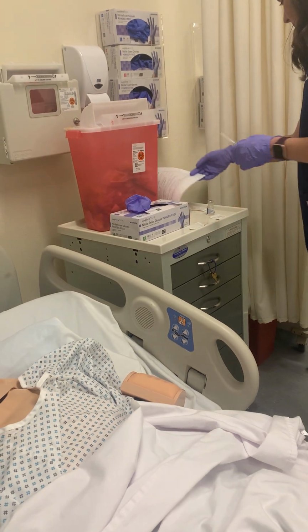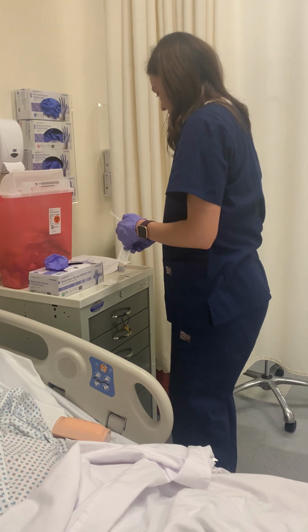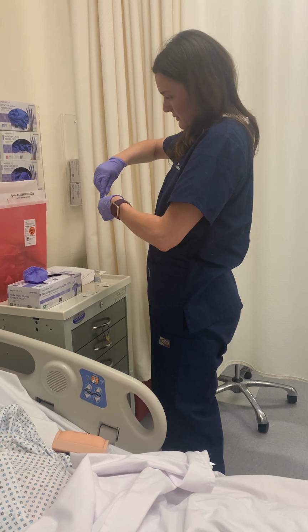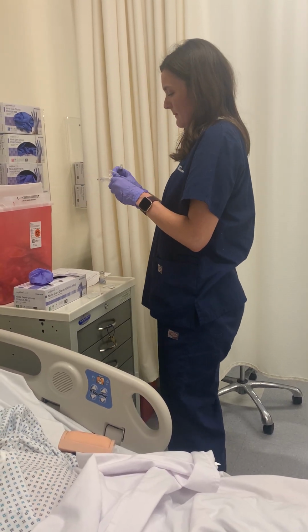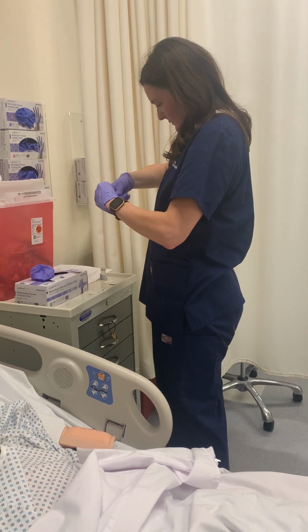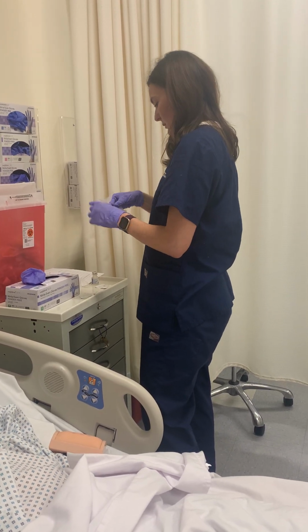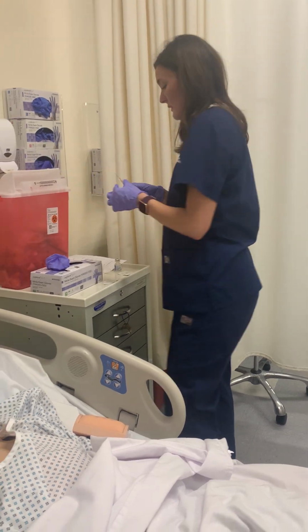So we are actually going to take my blunt tip needle off. Okay, that's good. Okay, I'm once again going to remove that, and I don't need that.